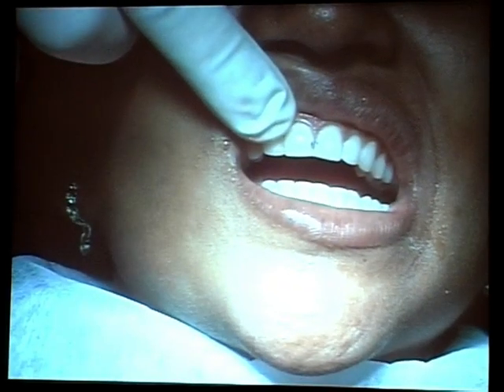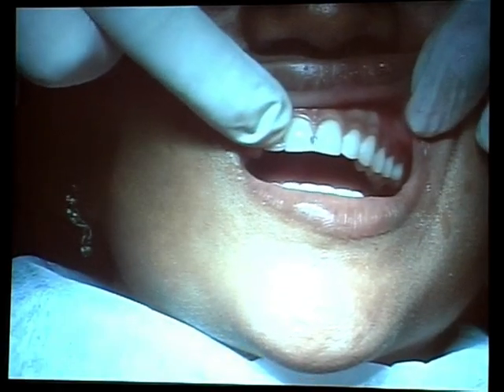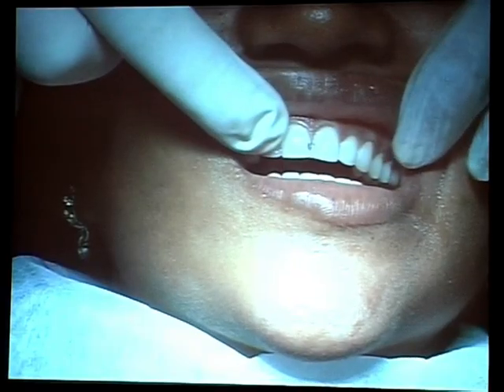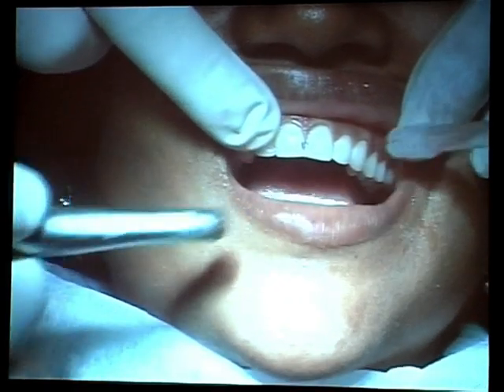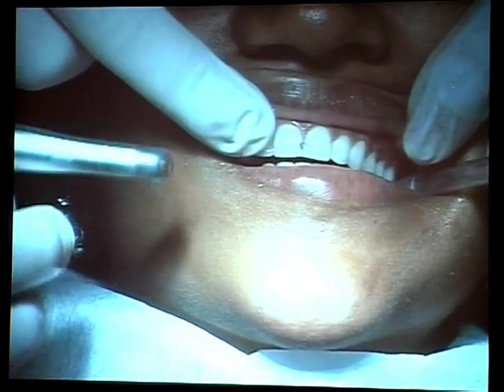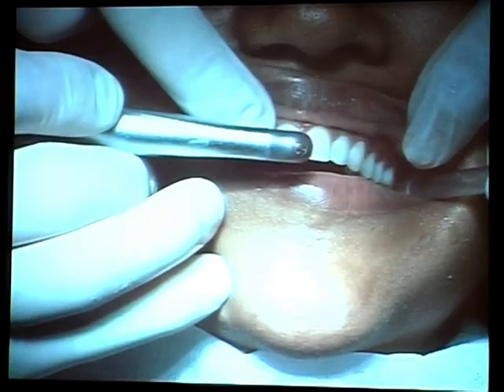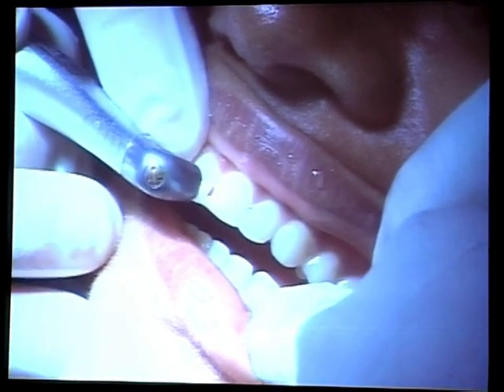Because I told you before, dentin is much softer than enamel, and dentin contains much more water than enamel. So we can reduce the amount of water because there's much more water in dentin. And we reduce the power because dentin is softer and because we don't want the patient to have a sensation.